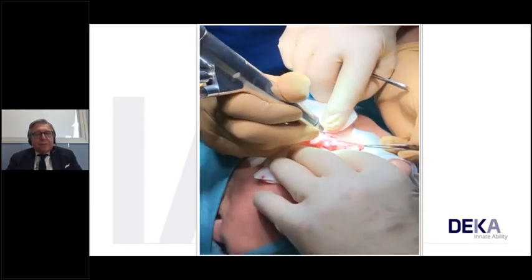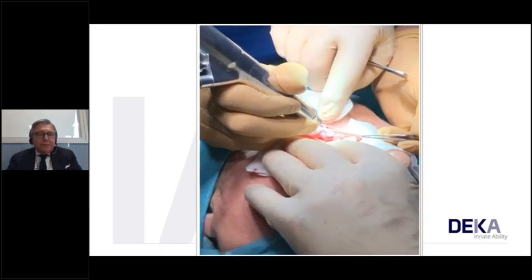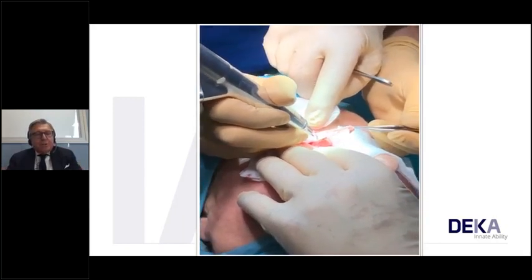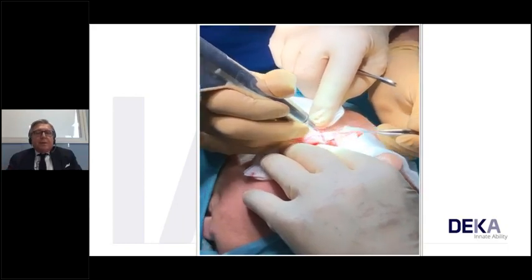We are talking about tips and tricks. It is one of the most important tips and tricks that we can do. Please hold the handpiece in this way. On the other side, we can use the opposite angle. Exactly.